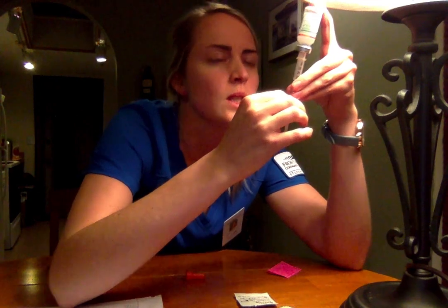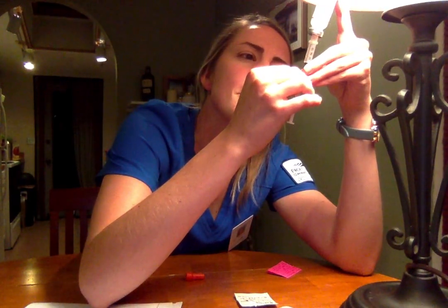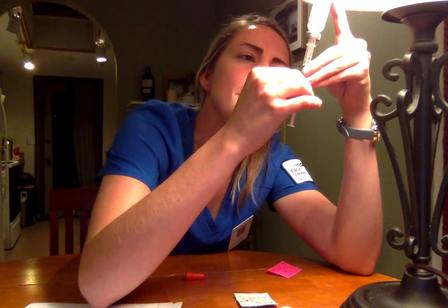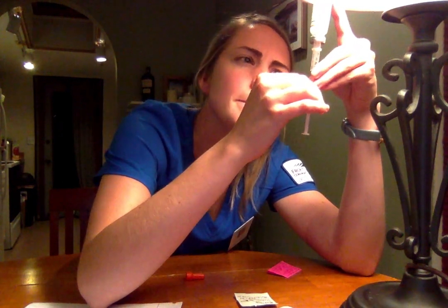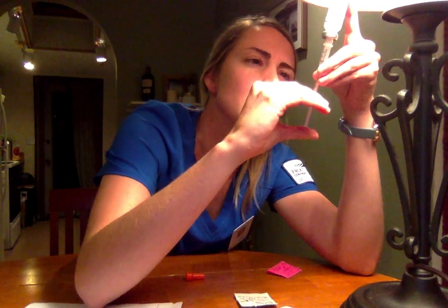Okay, checking for any bubbles. Okay, that looks good. So now I'm going to draw up to the 26 marking.